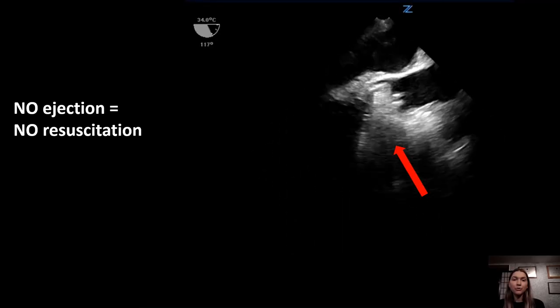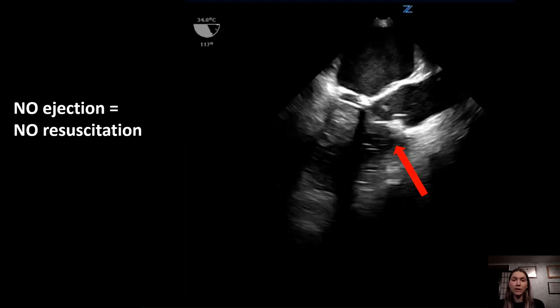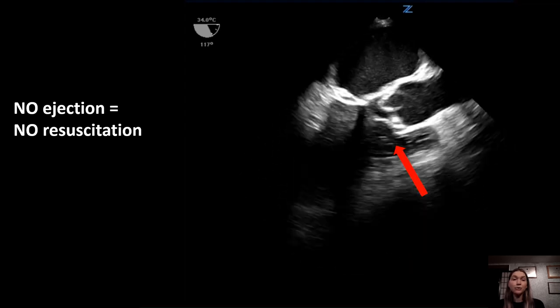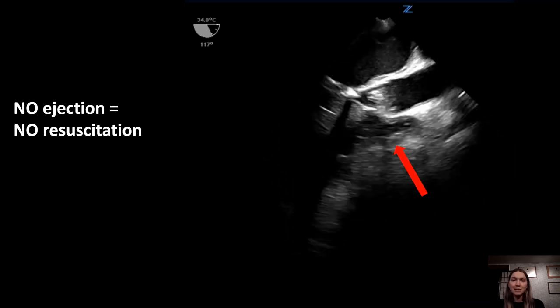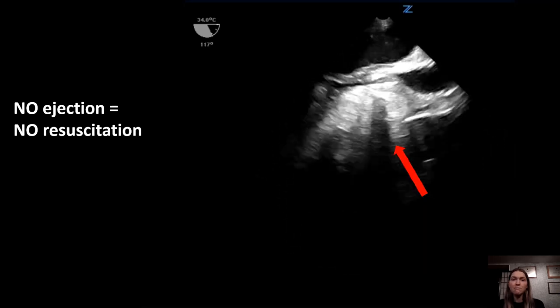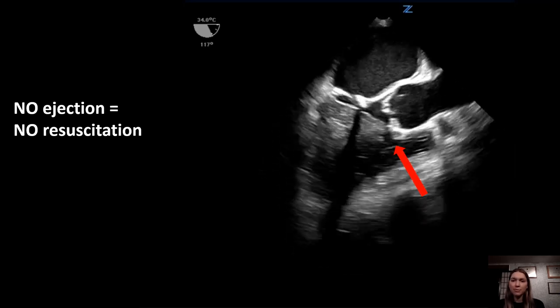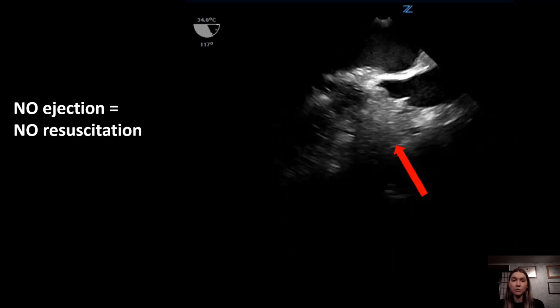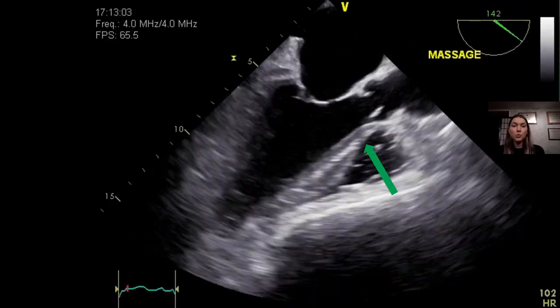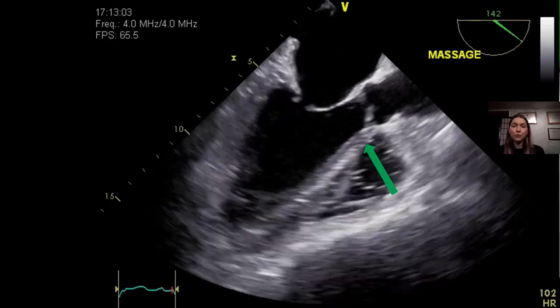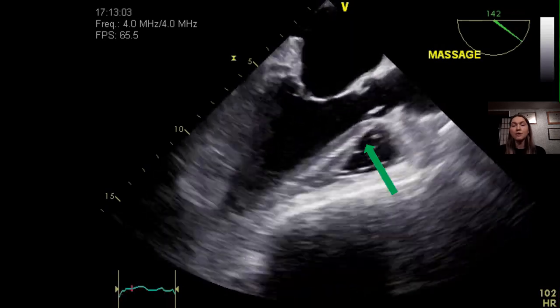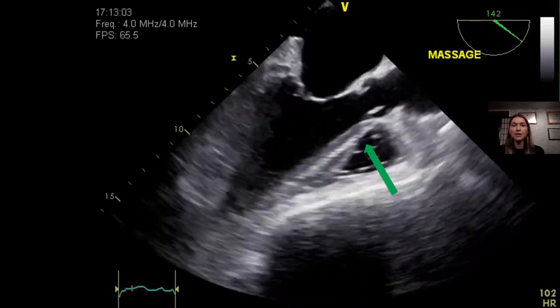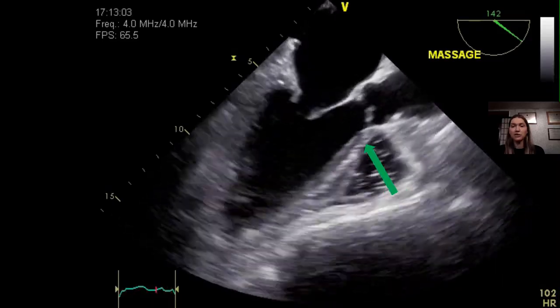In order to avoid complete obstruction of the LVOT and preclude resuscitation success, CPR quality must be monitored whenever possible, and TEE is an excellent monitoring tool for this purpose. The first goal is to make sure that the LVOT and aortic valve open during the compression phase to allow LVOT ejection.